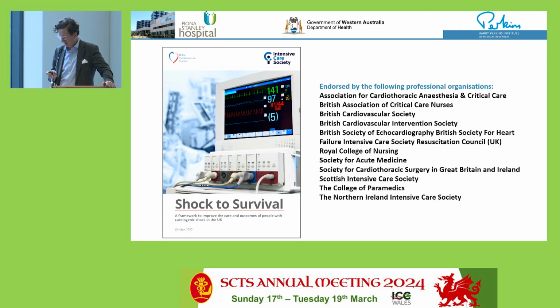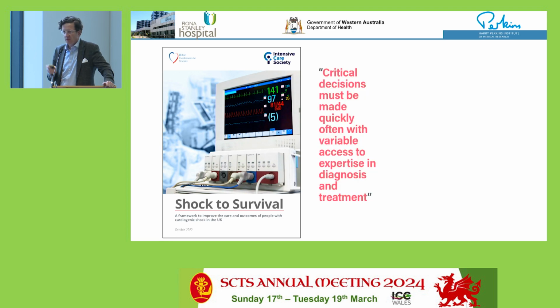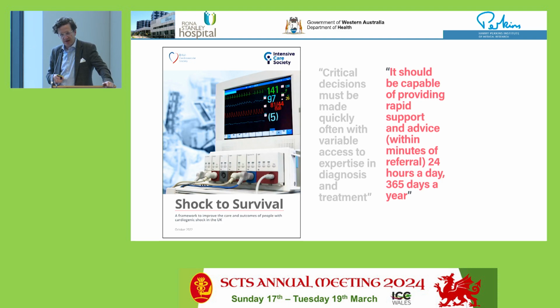And of course, I was part of and the representative of the SCTS for the Shock to Survival framework group, which was published in October 2022. We represented only one of the societies, the SCTS, and what is important, and you can download it, it's available online, is that critical decisions must be made quickly. You're on bypass, you can't come off bypass. Let's consider that you have already been on bypass 2.5 hours and you reperfuse another 45 minutes. You don't have 6-7 hours to make a decision, so it needs to be relatively quick. It should be capable of providing rapid support, so it's not just, okay, let's order it and have it tomorrow.